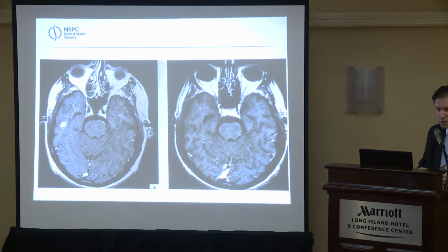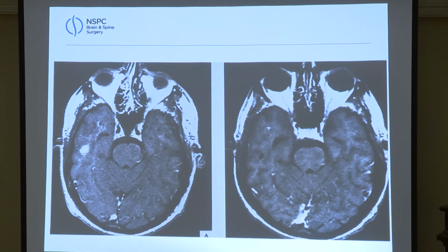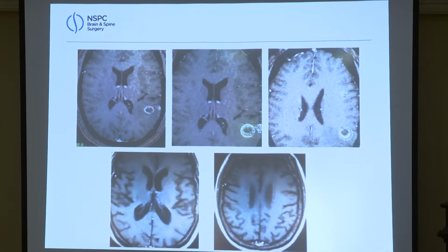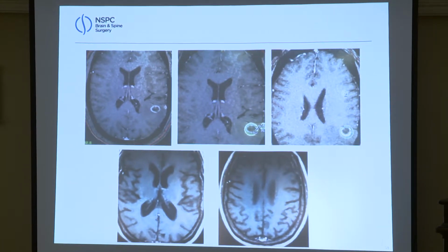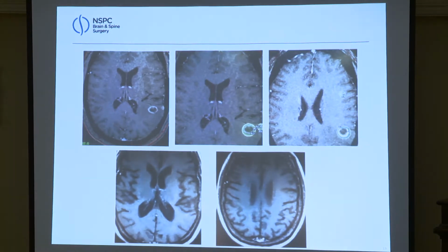You see the melanoma has responded beautifully, and people with radio-resistant tumors are particularly good for Gamma Knife and for radiosurgery treatments. This is one of my patients we did with Gamma Knife. This is a lady who had non-small cell lung cancer, one of the most common things we see.